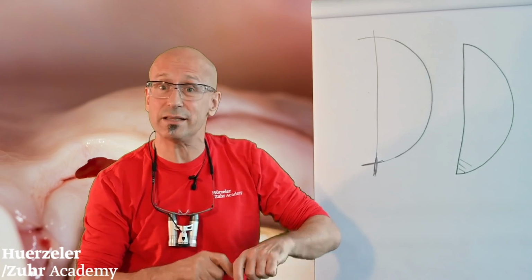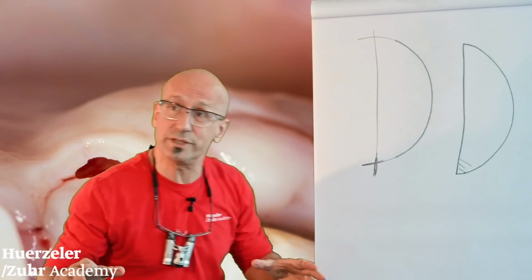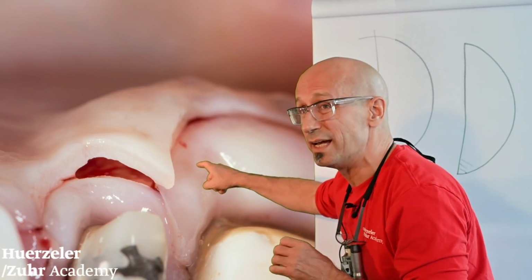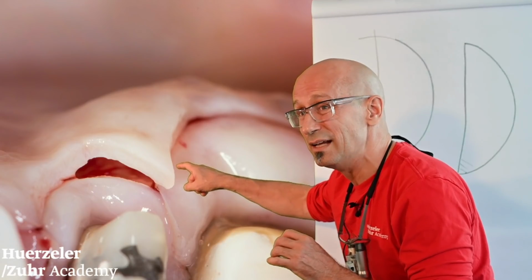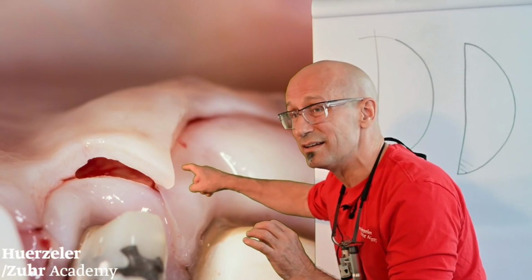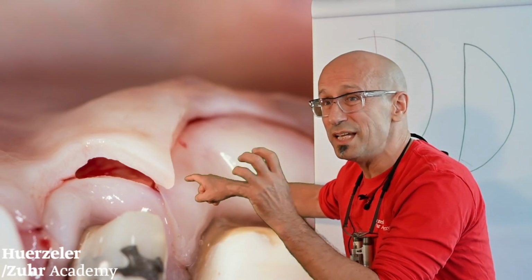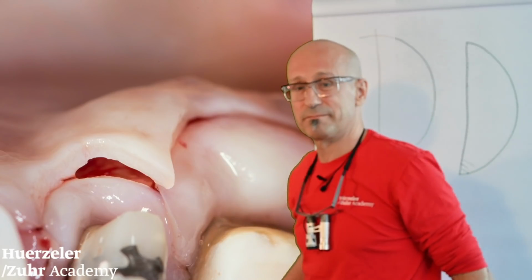This is important later on, when we come to the flap around teeth, and then we go back to this picture. Look, that's a picture I put here for you guys. That's the papilla we want to create. If you don't overcut here perfectly in the papilla, you will never have this design. This is your goal. What you can see here on this picture is what you need to achieve when you do a split thickness flap around teeth.